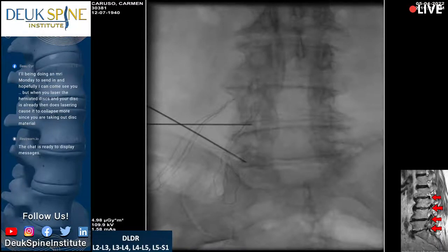You can see the laminectomy. Hold on. Show them the laminectomy defect. Flynn, are you on the X-ray? This patient, yes, sir. Not only does he have scoliosis and degenerative disc, outline that laminectomy defect. He's had a laminectomy. It's actually the Casper ghost. It's the whole ghost. So go up the edges of the laminectomy. You can see it. Yep, up, up, up, up, up. Keep going up, up, and now around and down.